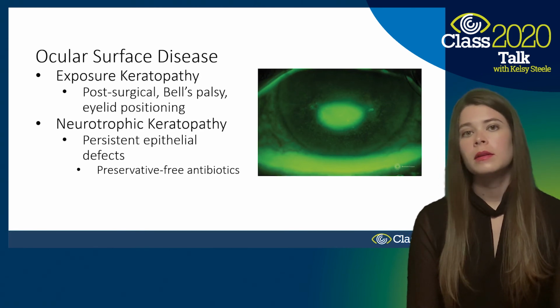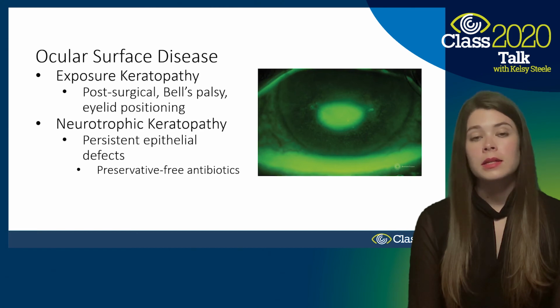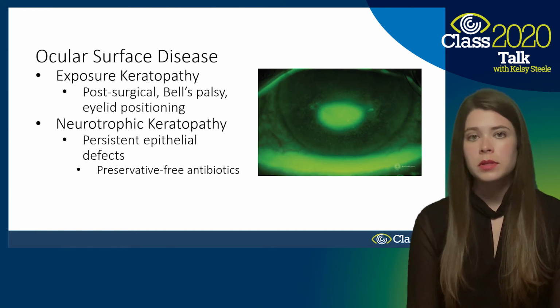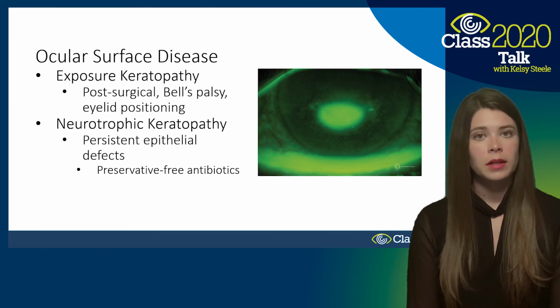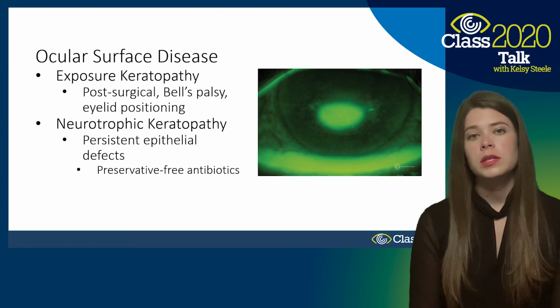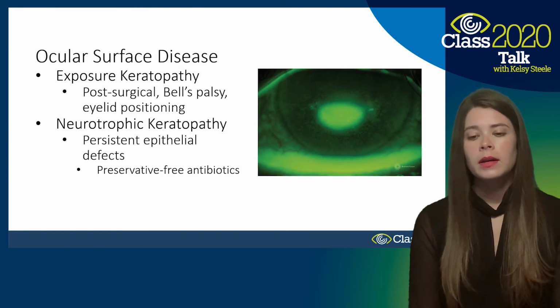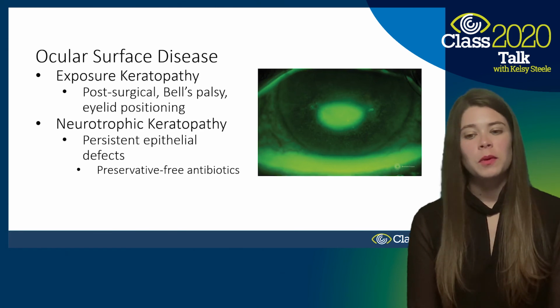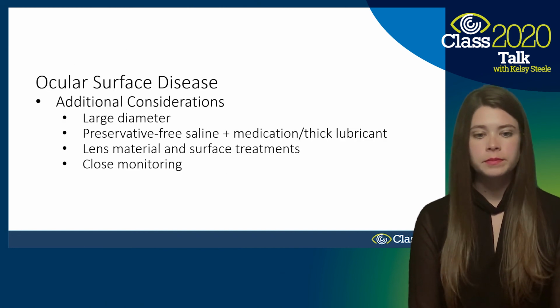One thing that's going to make those a little bit more unique is the addition of preservative-free antibiotics. So you really want to be careful with those PED patients that you're monitoring them very closely. Typically, you're going to see them every day because a lot of those patients will wear their lenses 24 hours a day and really just take them out to briefly disinfect, clean, and refill the bowl. But that's not something that you just let them go for a couple weeks. That would be something where you're seeing that patient every day. They have your on-call number, you're watching them closely, and also providing coverage with a preservative-free antibiotic.